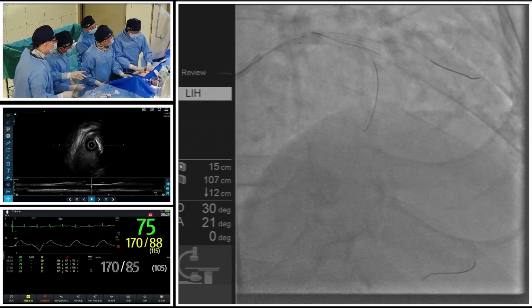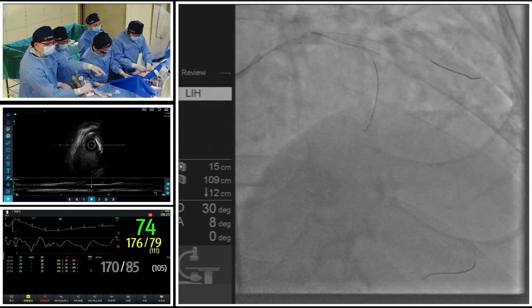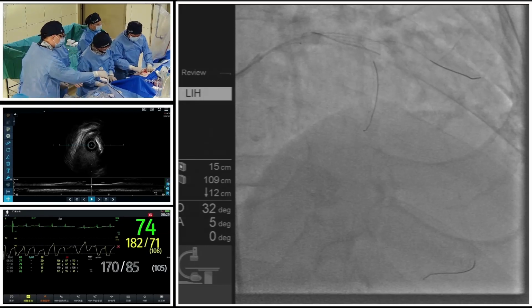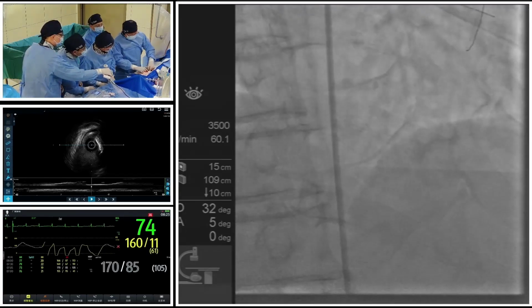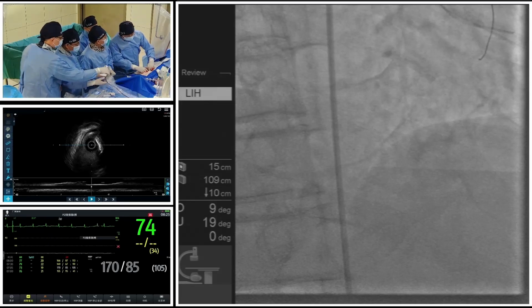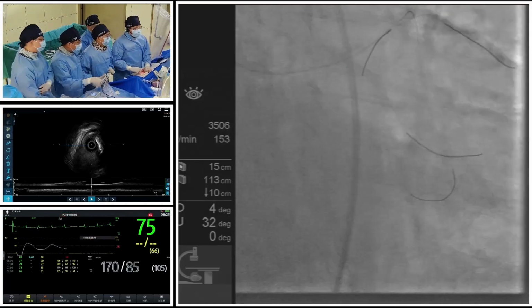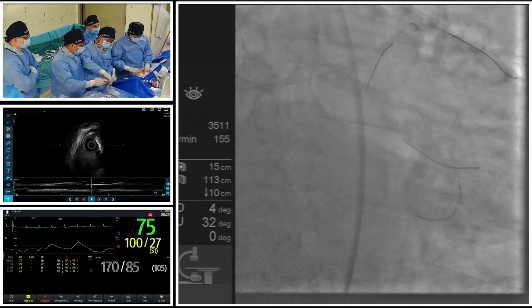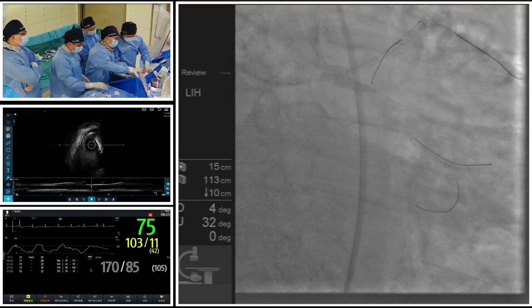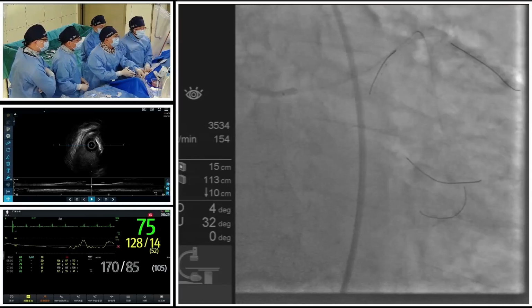Intravascular imaging is good. However, it cannot give you a whole view of the whole vessels and also the disease. This is, I think, the advantage of the 3D reconstruction system of the CTA. But certainly, the IVUS and the OCT are of great importance, and what we need is a multi-modal imaging system to help us. Okay. And our audience online just showed great interest in our software. I think that in the following demonstration, we can make some better explanation and demonstration of this software.